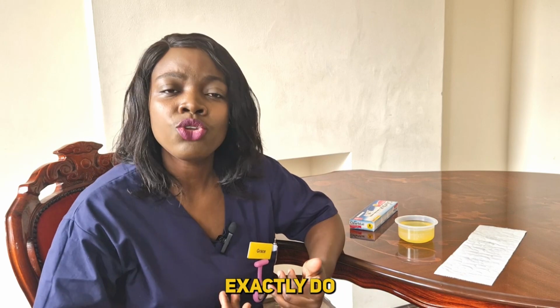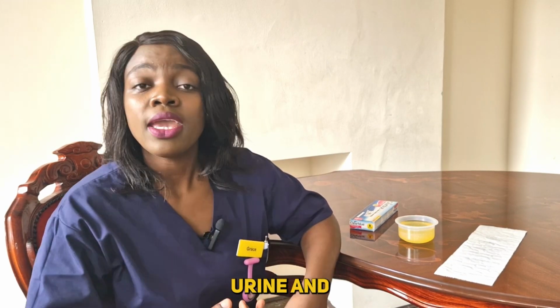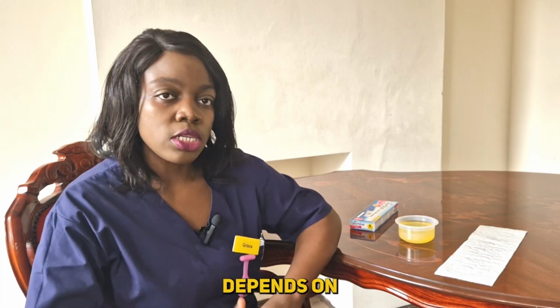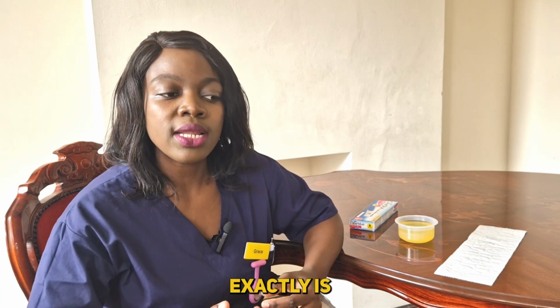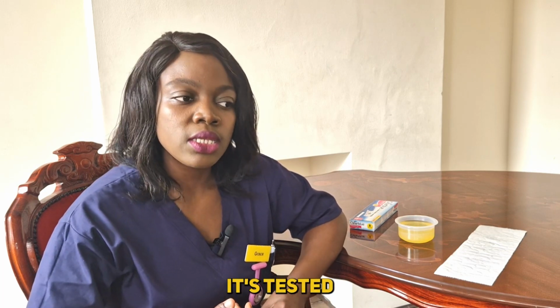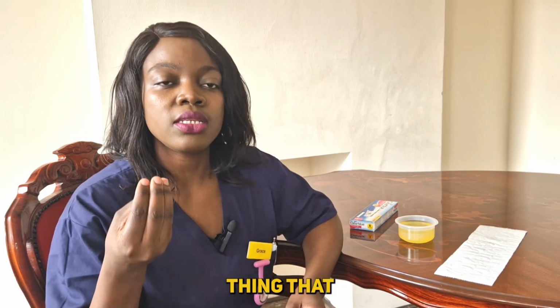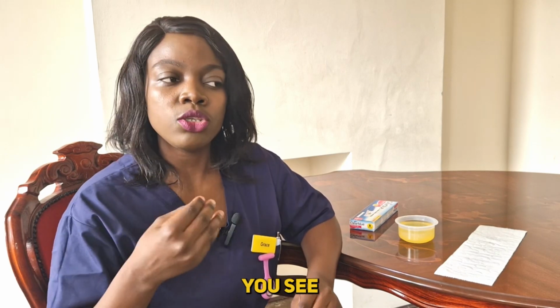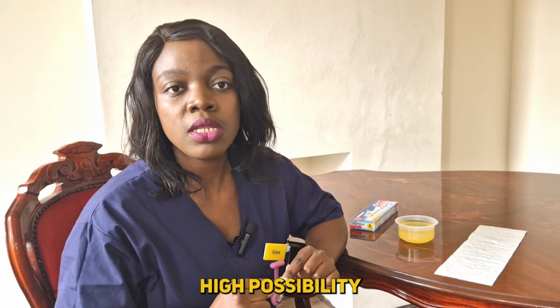And what exactly do we test in this pregnancy test? A pregnancy test can be of urine and can be of blood, so it depends on where exactly you are. What is tested is called HCG, human chorionic gonadotropin hormone. It's just a chemical, and that is the thing that is being tested. So when you see that your pregnancy test is positive, then it means that there's a high possibility that you might be pregnant.